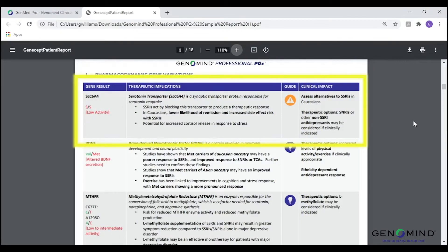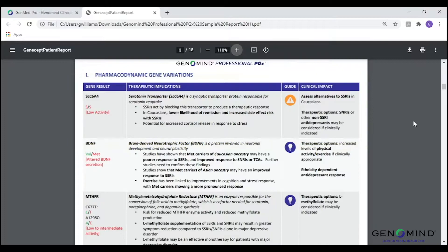Let's look at the SLC6A4 gene in a patient diagnosed with major depressive disorder as an example. SLC6A4 is the gene encoding for the synaptic protein responsible for serotonin reuptake. This patient has the SS genotype, which has been associated with a lower likelihood of depression remission and increased side effect risk with SSRIs in Caucasians. You'll see the caution symbol under the guide column, meaning this is information we would like the clinician to be alerted to. Looking at the clinical impact of this genotype, clinicians may consider assessing other non-SSRI medication options for their patient, as clinically appropriate.